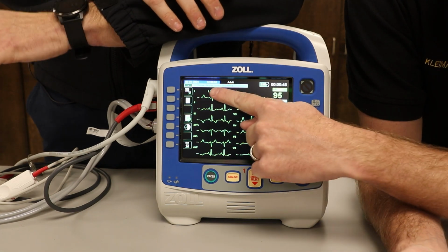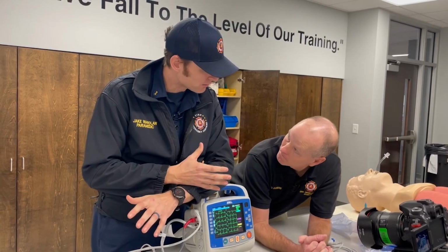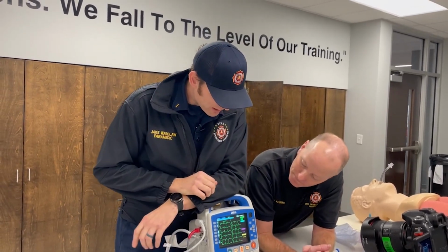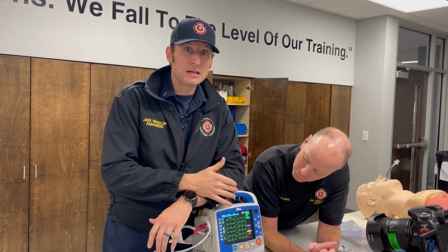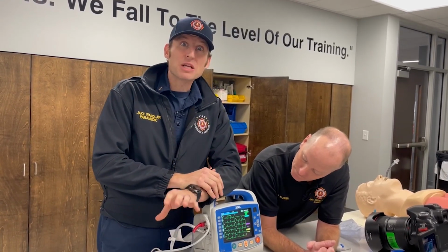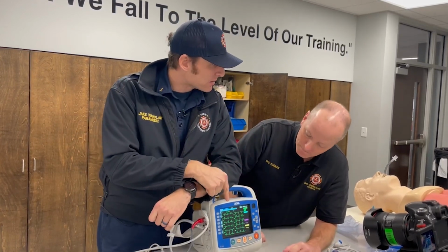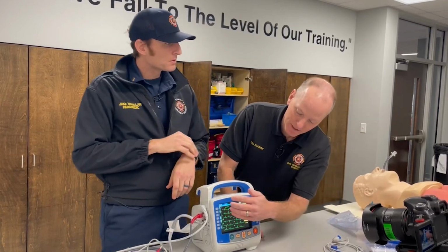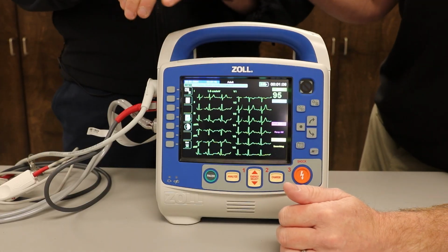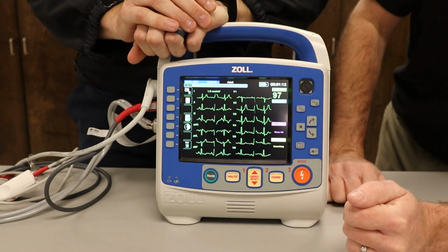I mean, we could put information in, we could take a picture, we can actually see what's going on with the heart from the 12 lead perspective, right? So what we're wanting to do here, and I will tell you, one of the coolest features about the Zoll monitor is you get a live feed. So from the EMT perspective, transferring over to a paramedic, I want to see that. Do you want to see that screen, David? I really do. And it's nice because if you put your hand on their pulse, you would actually see where the pulse is going, and you would actually see all the leads correlating at once.